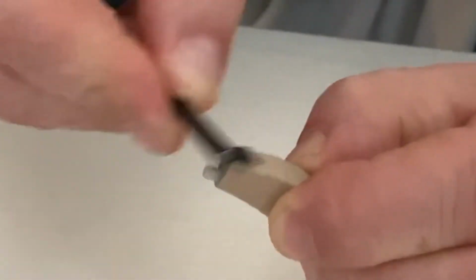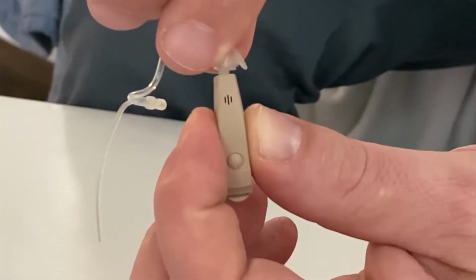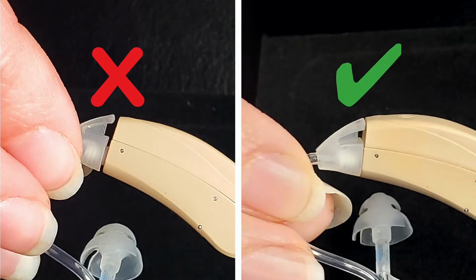Step 5. Brush microphone and ear dome. Clean daily. Step 6. Reattach the sound tube. Turn base of tube clockwise so it is flush with the body.